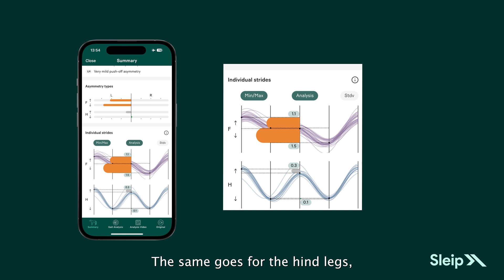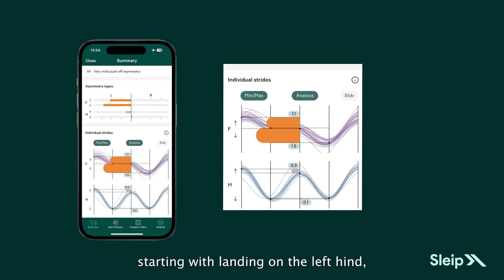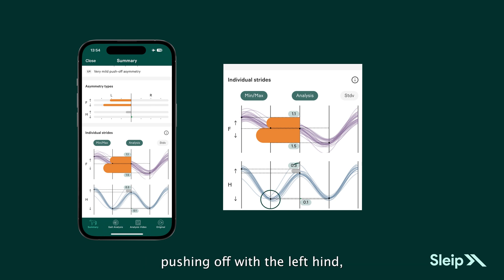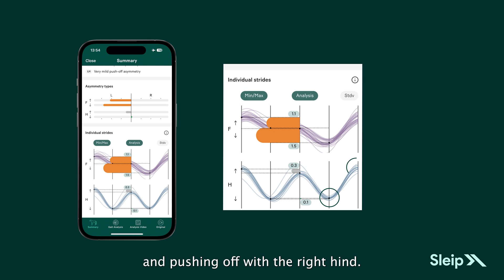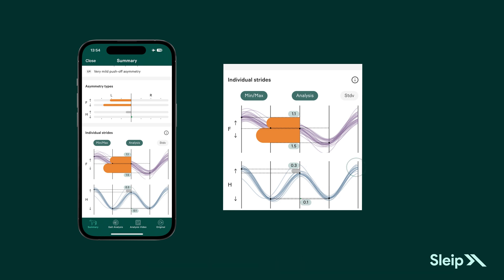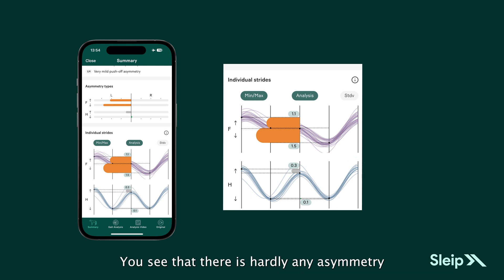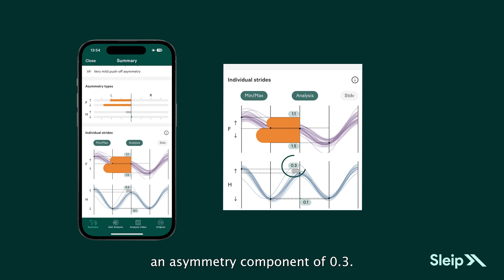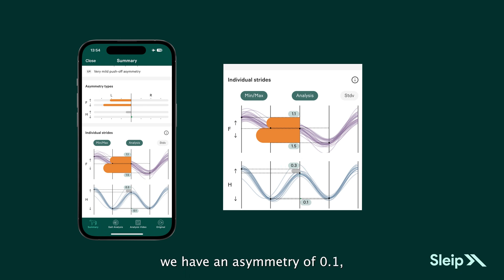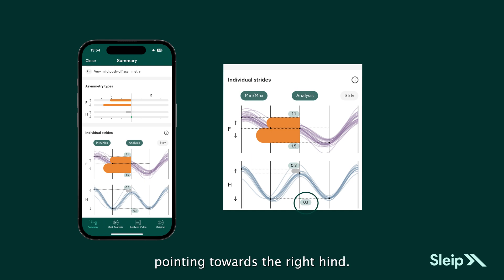The same goes for the hind legs, starting with landing on the left hind, pushing off with the left hind, landing on the right hind and pushing off with the right hind. You see that there is hardly any asymmetry here in the push-off — an asymmetry component of 0.3 pointing to the left. And in the impact phase, we have an asymmetry of 0.1 pointing towards the right hind.